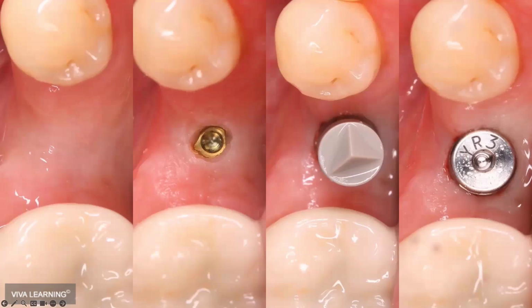I'm not doing the osteotomy with the laser, but I'm doing the initial punch cut that eases off some of the initial pressure I have to apply on that first twist drill to get through the cortical bone. So boom, laser punches the hole, kind of like the round bur used to. You're not skittering that thing across there, and then you're just dropping right in.